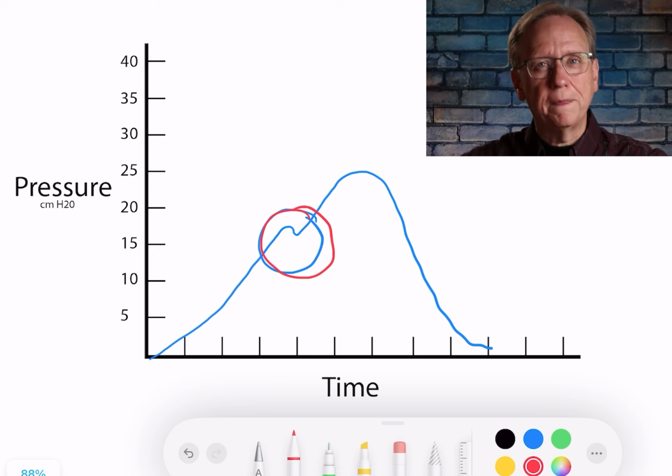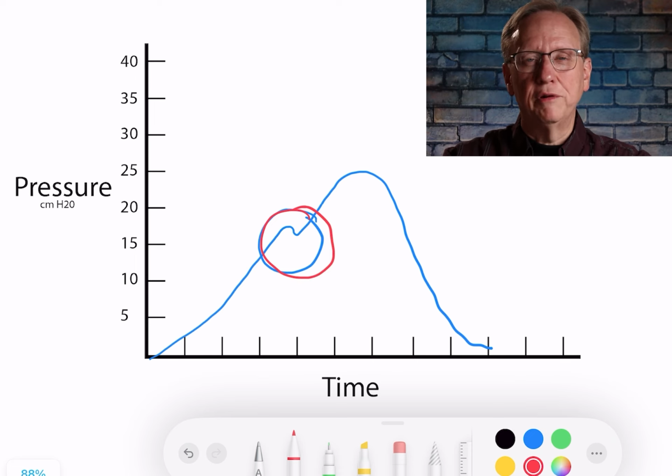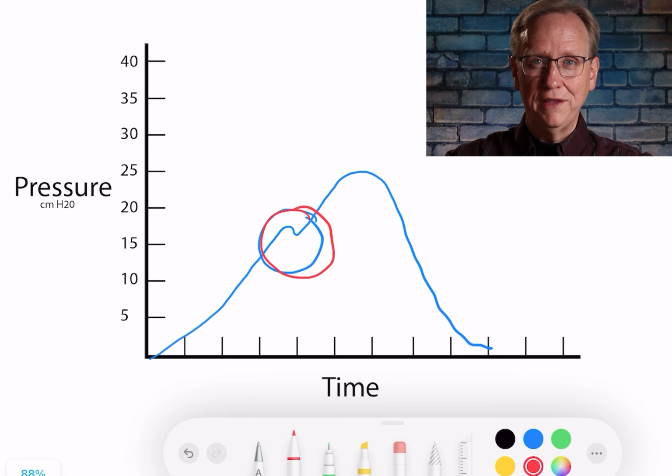What's happening to the patient is that the pressure is beginning to build as the breath is delivered, but they are taking their own breath. And if they're taking in the breath faster than the flow that's being given to them, then the pressure will cause a slight deflection. The ventilator doesn't know what to think about that. It's just that the pressure is being taken away from the person trying to take a quick, deep breath.